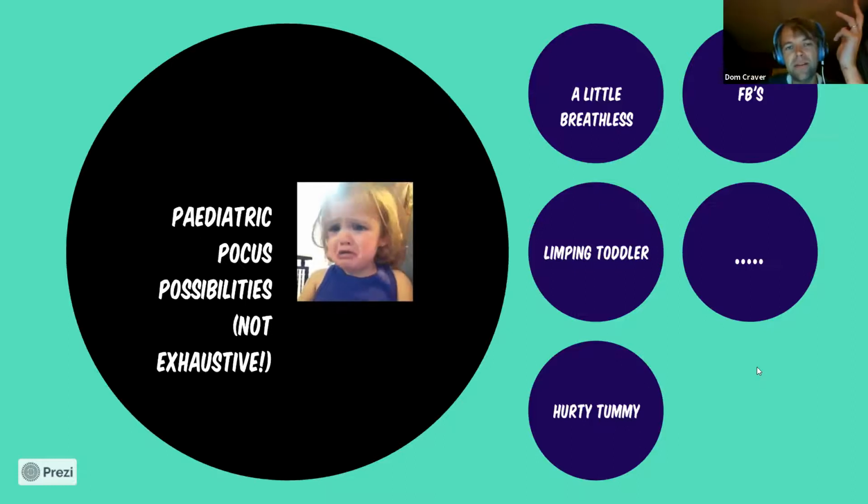Just got to be careful. There've been a few times I've been a bit unsure, and the formal scans have also been a bit elusive. But if it's an obvious swelling like that, that's quite satisfying. So don't use it as a rule-out thing, especially if you don't have the right governance or people around you to help you out.